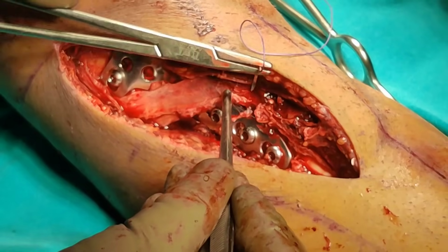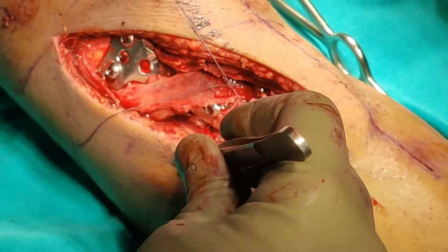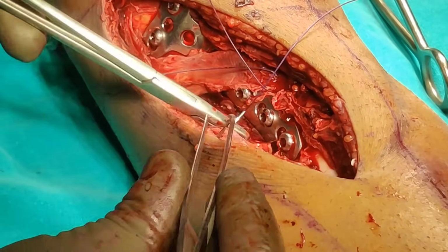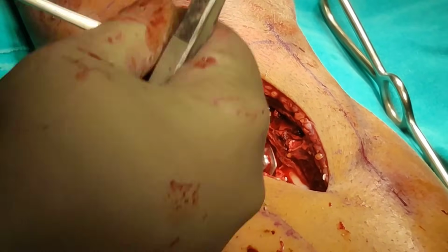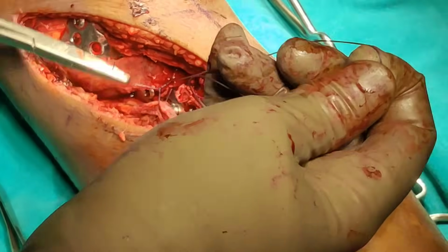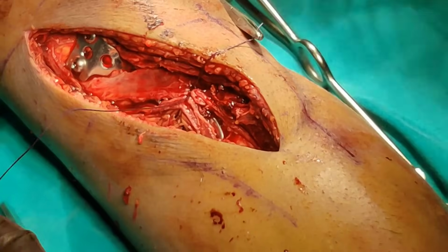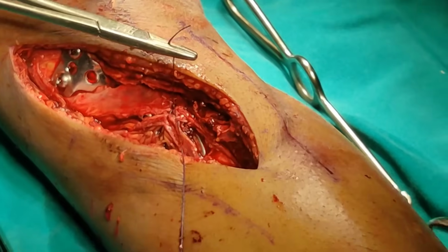So I'm starting with this corner. I'm just using a number 1 Vicryl, and then I'm just taking this. Now you need to restore the anatomy, and you will be able to restore the anatomy only if your dissection is in layers and you have identified the layers. So once you have identified your layers correctly, closure becomes a piece of cake.